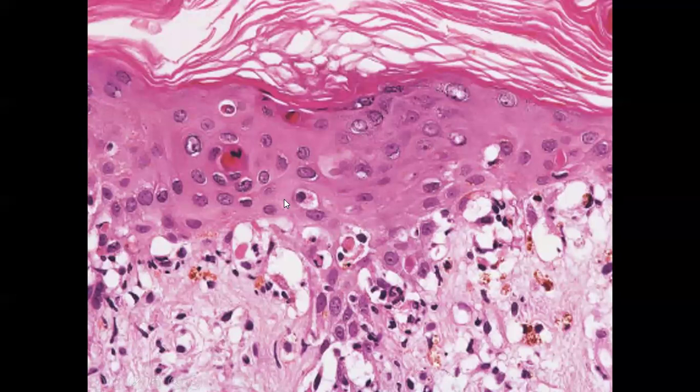Erythema multiforme is characterized by an interface change. So by interface change, we mean that there is disruption of the basement membrane, there is basal cell liquefactive degeneration, there will be pigmentary incontinence, as you can see. There are colloid bodies, which are the necrotic keratinocytes. In addition to that, the necrotic keratinocytes are also seen within the epidermis, which is called single cell necrosis.